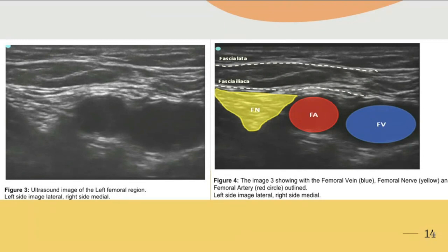What I'm trying to highlight is that the femoral nerve is highly variable in appearance. So the most important thing is to make sure that you identify the iliacus and the fascia iliaca correctly, and then track the structure cranio-caudally, so that you can get consistency and properly identify the structure. There have been times when I could not identify the femoral nerve readily, and I will just put a needle below the fascia iliaca, head towards the femoral artery, hydrodissect, and see what structures I'm able to identify.